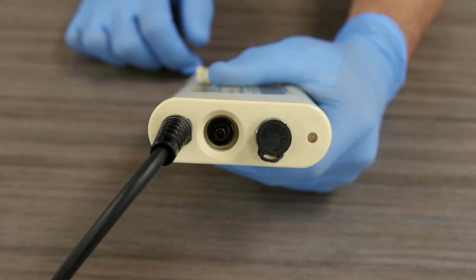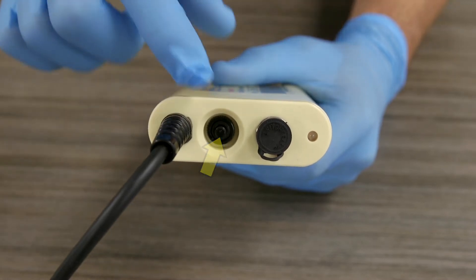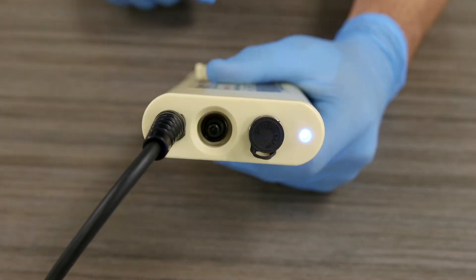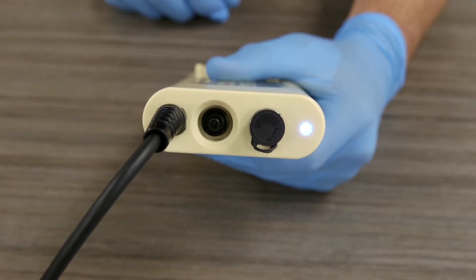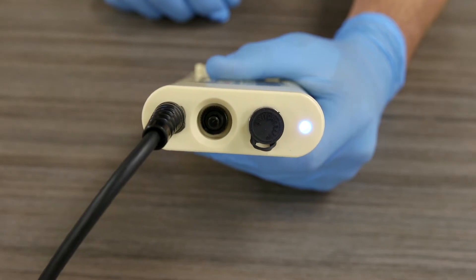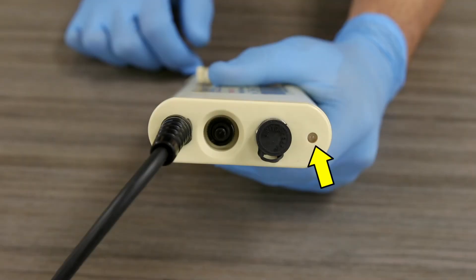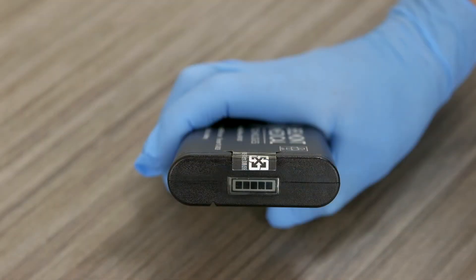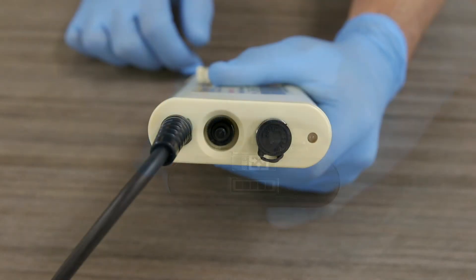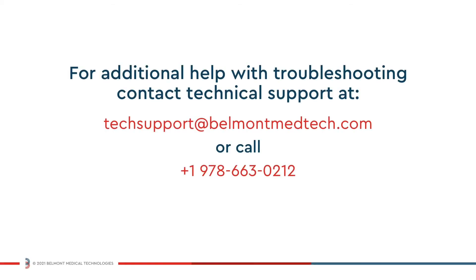Now you are ready to power on the unit. Depress the on/off switch on the battery housing to supply power to the heater unit. Correct operation is confirmed by continuous illumination of the blue LED after a brief flash of the red LED. Warming will initiate within seconds after the device is powered on. If the blue LED does not illuminate, make sure that the battery is charged. After confirming that the battery is charged and the LED still does not illuminate, please contact customer service for assistance.